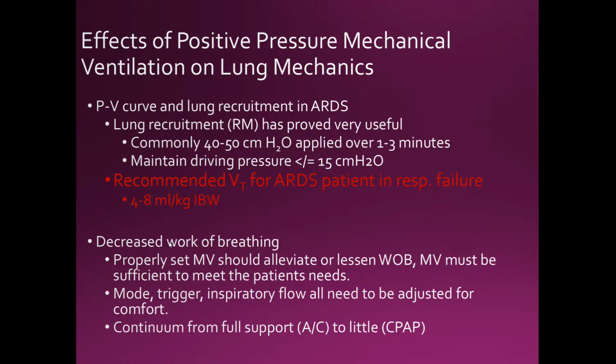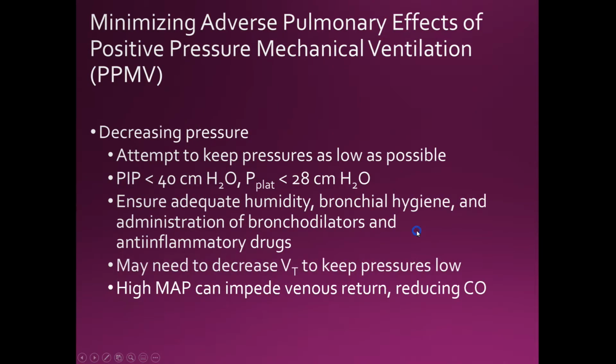Okay, so for work of breathing, when the patient is breath stacking, air trapping, auto-PEEPing, whatever you want to call it, you want to set the sensitivity 1 to 2 centimeters of water pressure below that baseline. And that is why baseline is very important in mechanical ventilation, because not only do you see where they're supposed to return, you can also adjust for any situation where they have increased work of breathing.